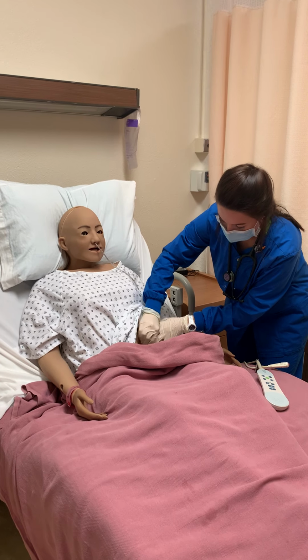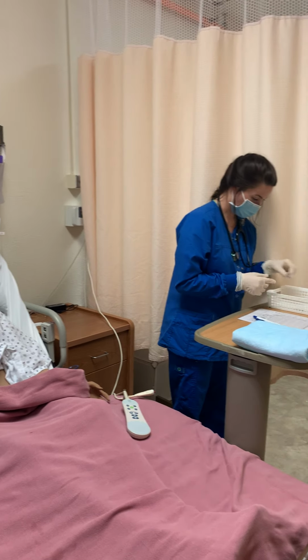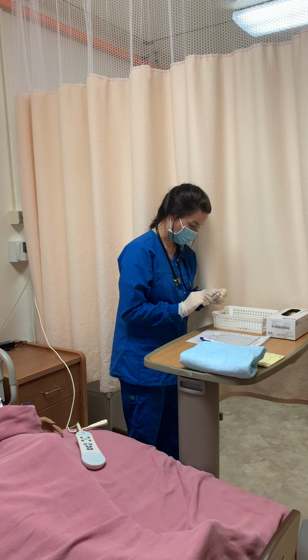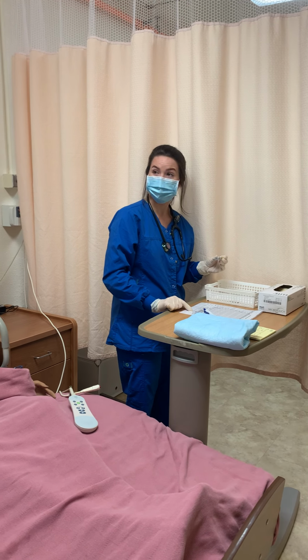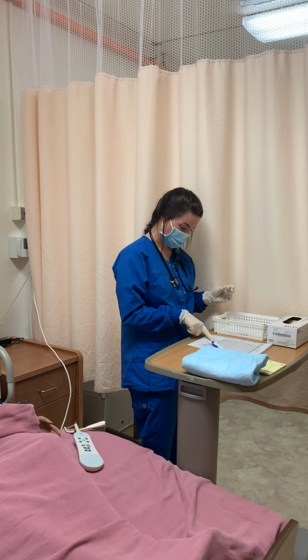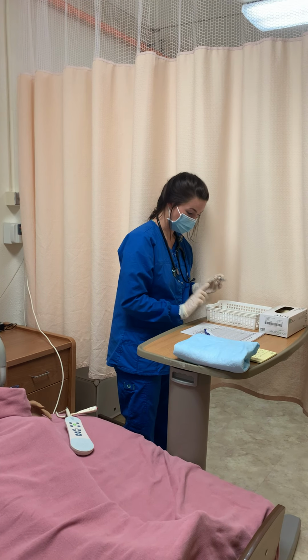This is a sub-Q injection. And then, once again, I'm going to do my third check now. So I have my Lovenox here, making sure I have the right amount, 40 milligrams. Joanne Jones is my patient, date of birth, 12/3/67. And then Jeff Moberg is her doctor that prescribed it. It's 10/19, and it's her 8 a.m.